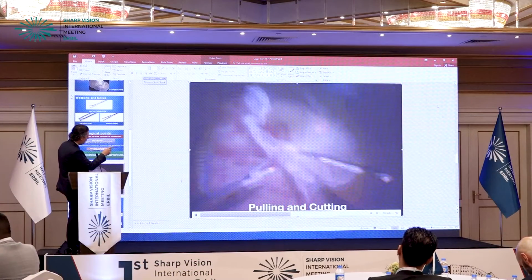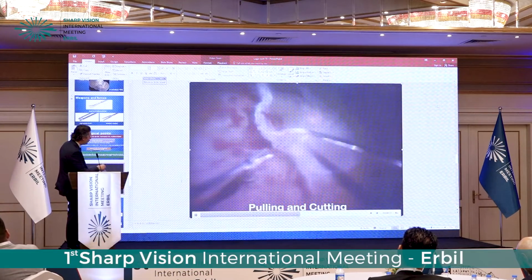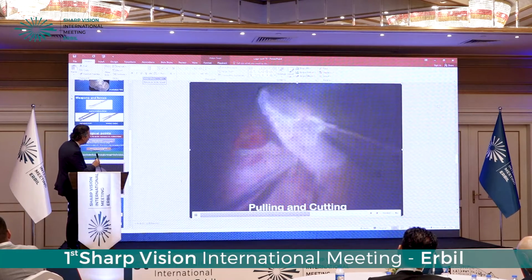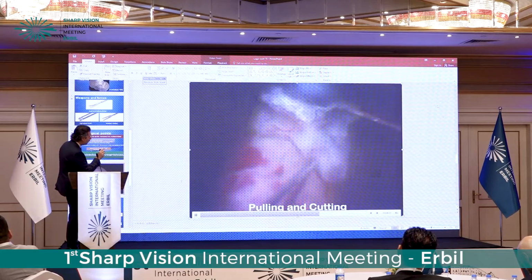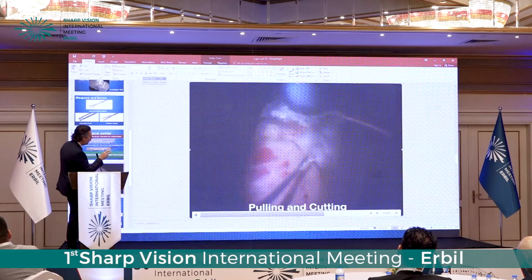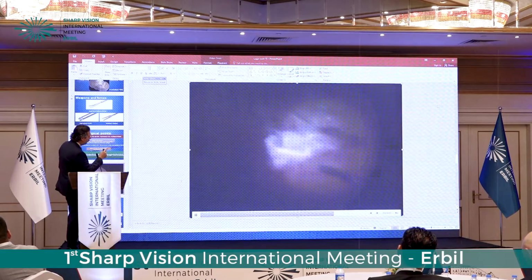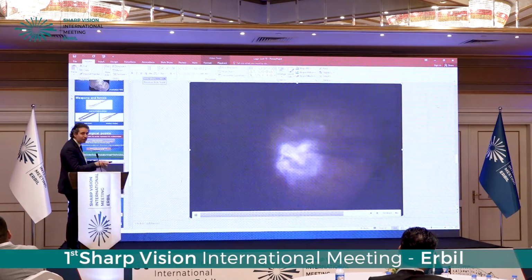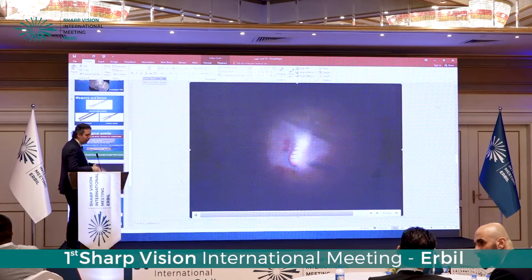You are seeing points of traction, which are the legs of the bridge. You can cut them one by one. I have an important notice here: don't hesitate to cut them, and don't be afraid of the horrible bleeding, because the neovascular tuft will empty and obliterate because you are cutting the feeders. So they are not connected to the retinal vasculature.